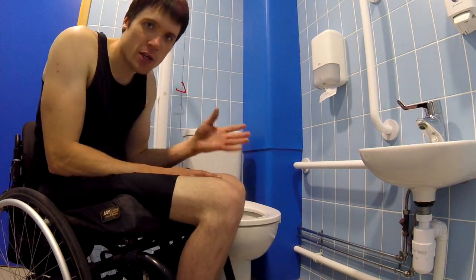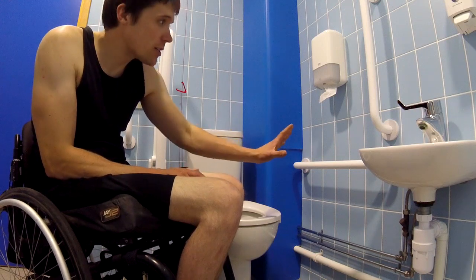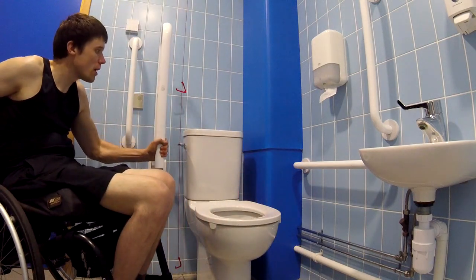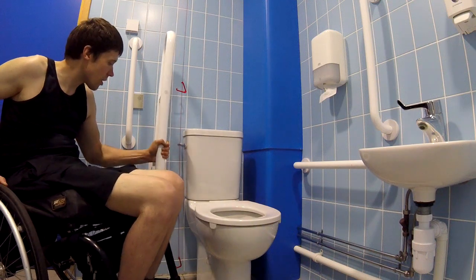This is a quick video talking about the kinds of bars you find in the back roof. This is a typical setup. You'd have a vertical bar here, a horizontal bar here, and you would also have this bar which moves up and down and locks in place.